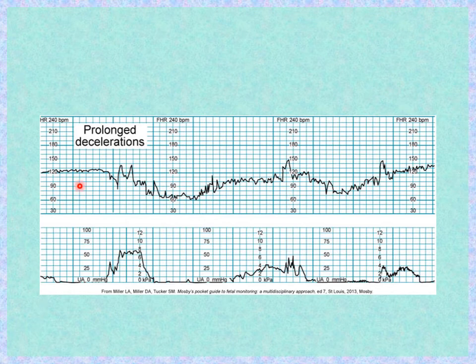the deceleration. In these prolonged decelerations, once again, you see that it looks like probably mom is pushing. You may see some prolonged decelerations during pushing. In this case, depending on how close we are to delivery, I might give the mother some oxygen. I might coach her on breathing. It depends on exactly what's going on in this situation.